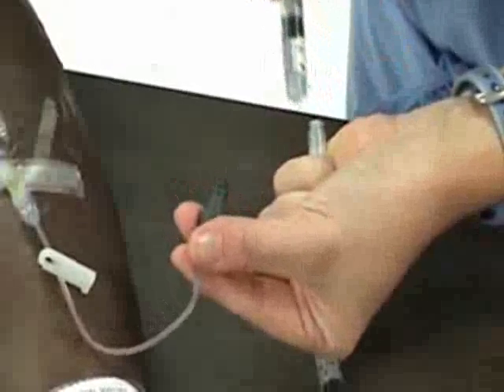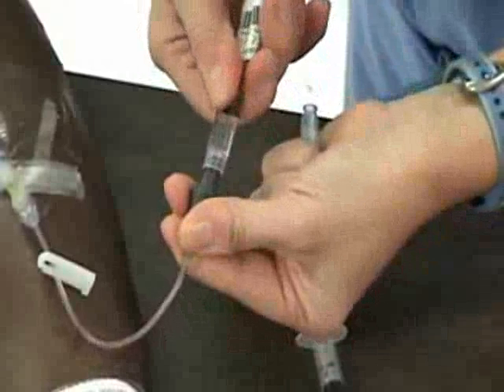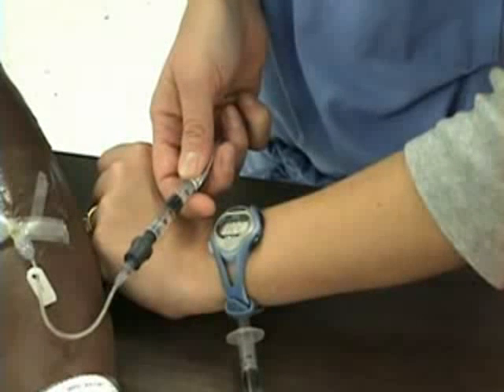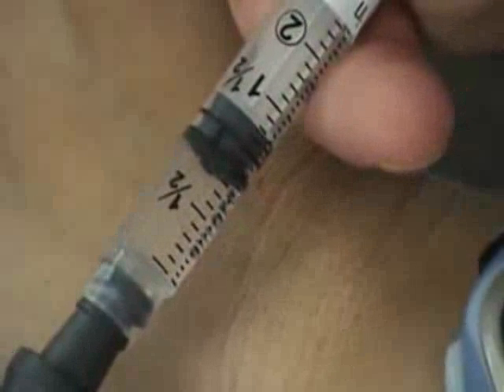Next, I will attach the Reglan to the saline lock. I am going to be looking at my watch and the markings on the syringe at the same time. I now will push this medicine at a rate of 6 seconds per line.